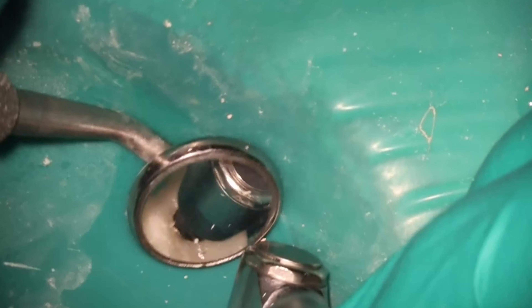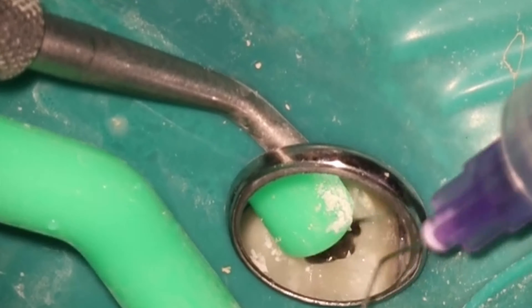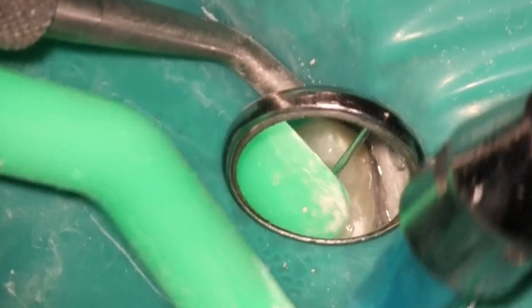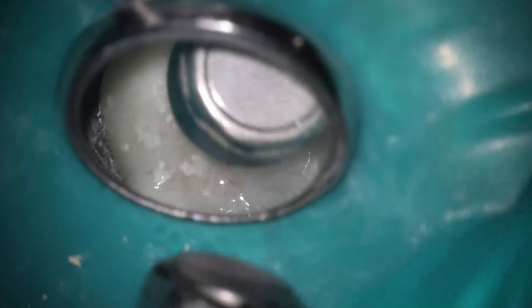I would recommend using a slightly stiffer file — something like a 14 or a 17 — if you have to punch through dental shavings; it's really tough. In this case I used the 2006 from SS White, actually it's the SS White original shape but it's Brasseler for their V-taper series. It's a little stiffer and makes it more predictable to get past that area. We are almost patent — had a little bit more work to do to make sure we got all that gutta percha out. Final size on the buccals was a 2006 at the apex; the large palatal I just took to an F1 because that's kind of the natural shape of it anyway.